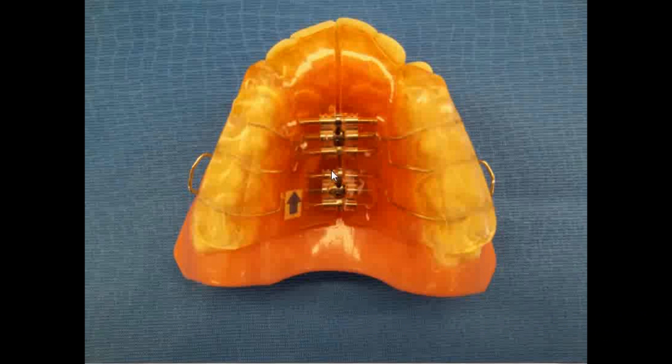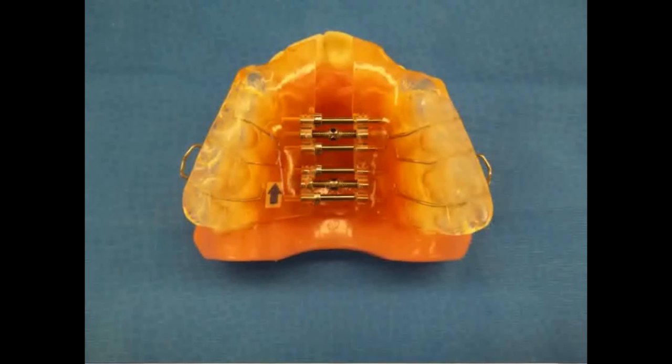The appliance has two screws. Two screws provide more force and eliminate the possibility that a screw can back up because there's too much force on it. This sometimes happens in adults when the bone is very dense. The transverse expander is also very useful if the patient has a posterior crossbite. The occlusal coverage allows the crossbite to be corrected without interference.